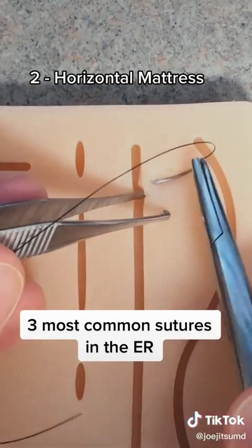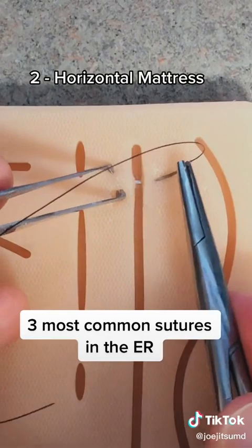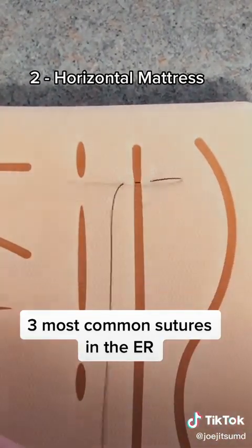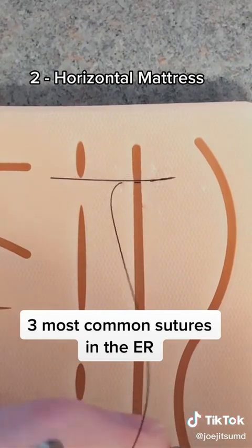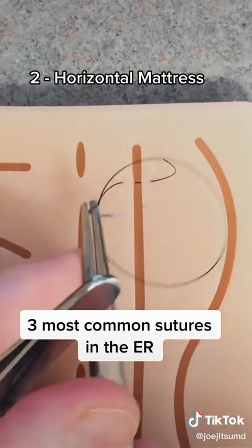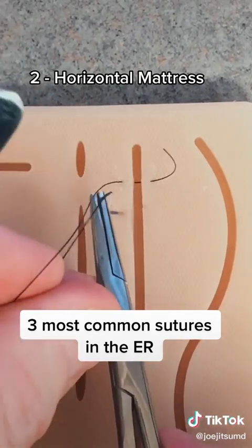The second most common suture type is a horizontal mattress suture. This suture is particularly useful when the wounds are gaping open and require a lot of tension to hold them closed. After going from one side to the other, we're going to reverse course and go from the second side back to the first.